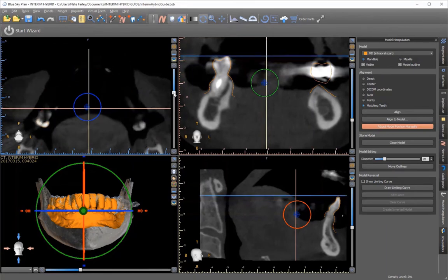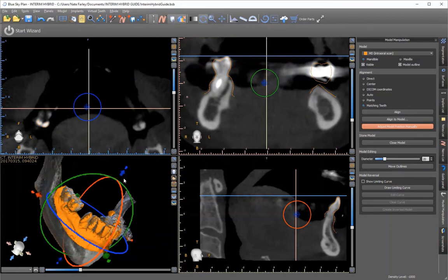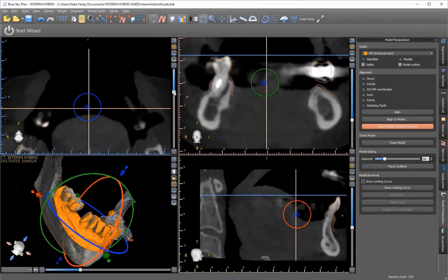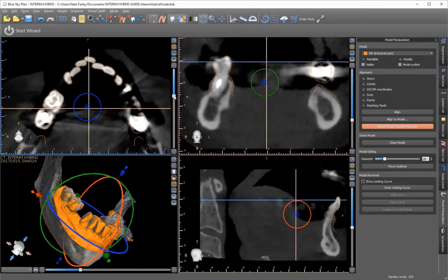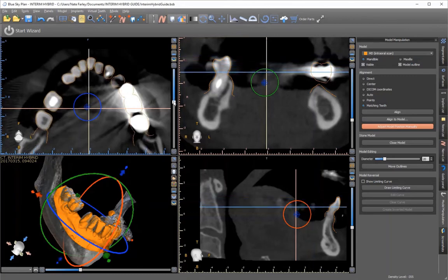One of the best ways of making sure alignment is there is to get it so that as you're coming right down through, the second you start seeing those cusp tips, you're also seeing the cusp tips from the STL file.